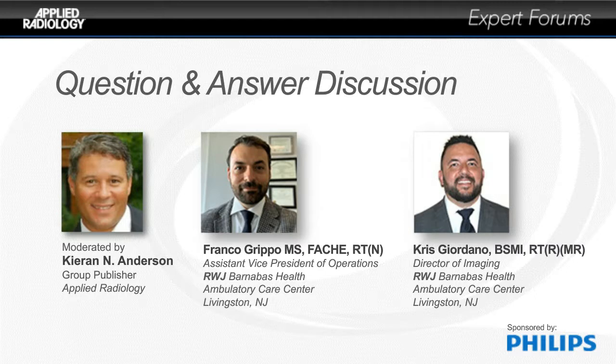The downside to having a really good system is that word travels fast, and we're seeing a lot more referring physicians, like Kris had mentioned in his talk, now shifting more towards that 3T and requiring that 3T on their patients. So we work well with the referring physicians to let them know that certain patients may benefit significantly on the 3T because of the image quality and the throughput, and others not so much. So we do work well with them to make sure that we put their patients on the best systems.